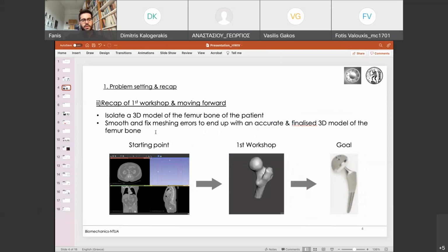So in the previous workshop, we got a 3D CT scan from a patient where we were able to isolate the cross sections which included the bone. We were able to distinguish the bone from the muscle tissue and the veins and all the associated stuff. The difficult part was to distinguish the ball of the bone from the pelvis, because it's essentially a ball and a socket, and the boundary between the ball and the socket is sometimes hard to distinguish. So we were able to distinguish that and extract a 3D model of the top part of the femur bone.